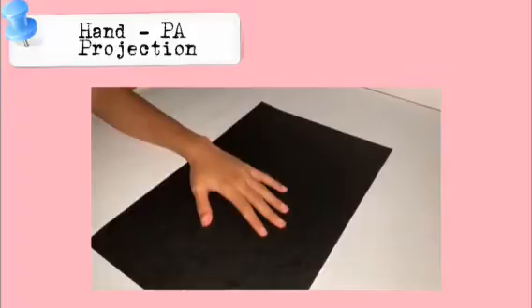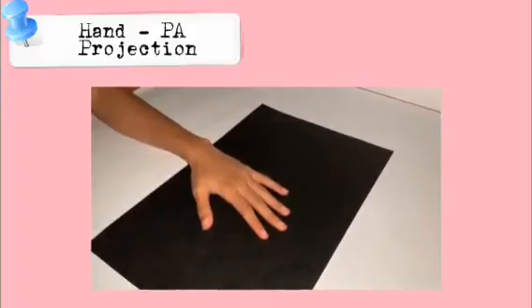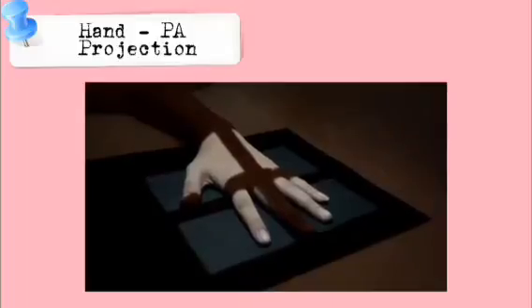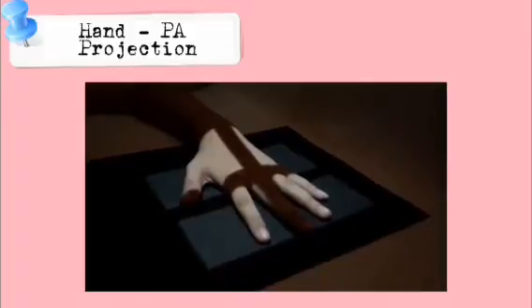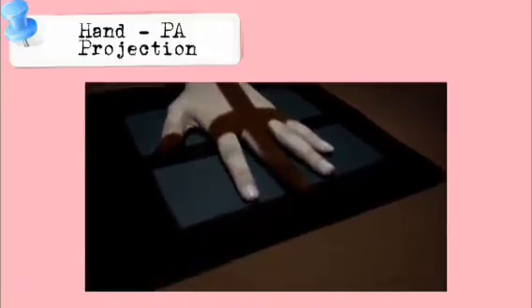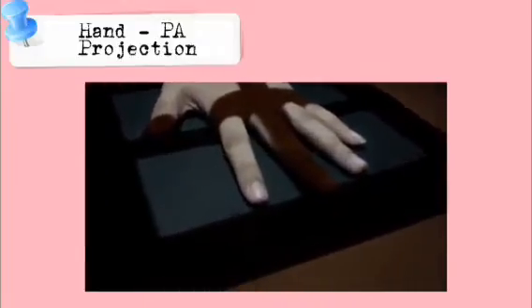Rest the patient's forearm on the table and place the hand with the palmar surface down on the IR. Center the IR to the MCP joints and adjust the long axis of the IR parallel with the long axis of the hand and forearm. Spread the fingers slightly. Ask the patient to relax the hand to avoid motion.